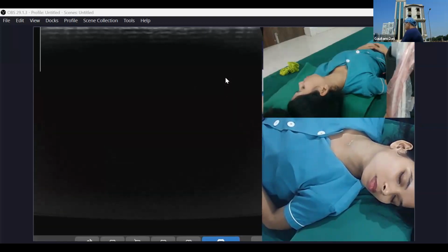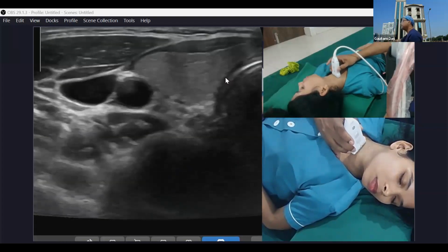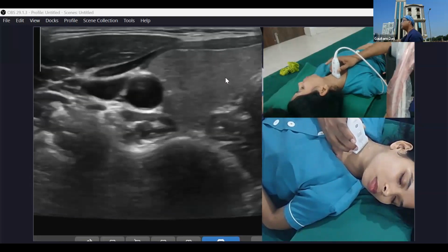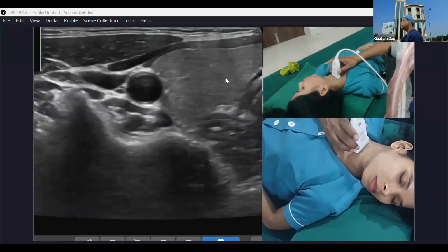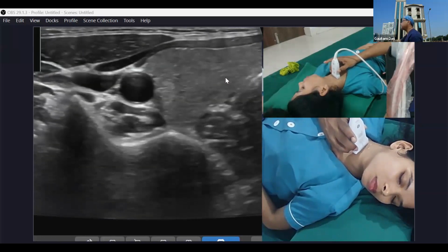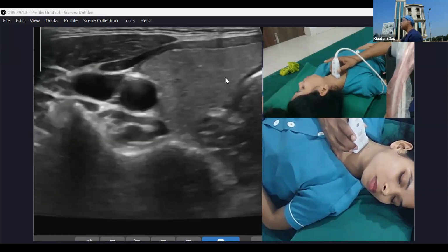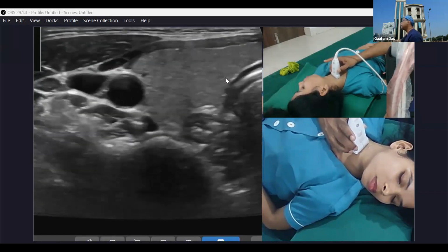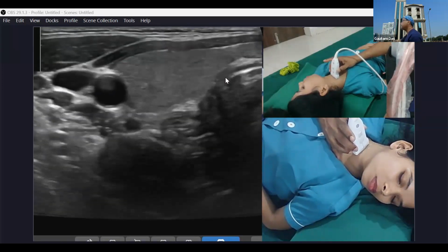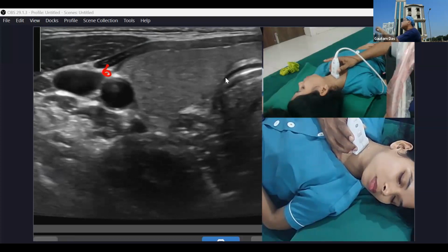So, again, this was the home page. Anterior tubercle, large anterior tubercle, and the C6 nerve root is coming out. So at these positions, longus colli muscle just below the carotid artery, jugular vein, you can see, and the vagus nerve also in between the jugular, this on the top, in the middle between the jugular. This is your vagus nerve.